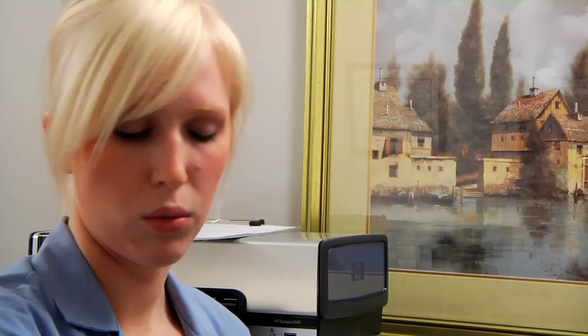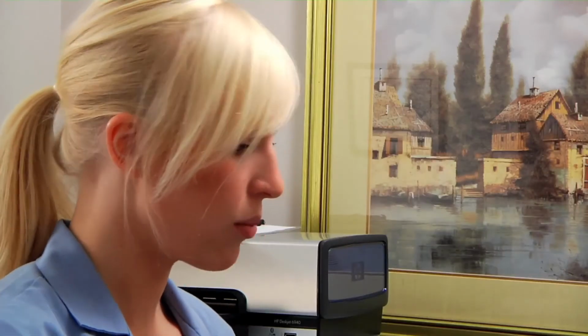Now that we have the patient entered into the database, you're going to set them up for their resting period. What you're first going to do is tell the patient that they're going to need to relax for a few minutes. In reality, you need to relax for 10 minutes for this test. It's very important that there's a resting blood pressure that's entered into the software before you perform the test.